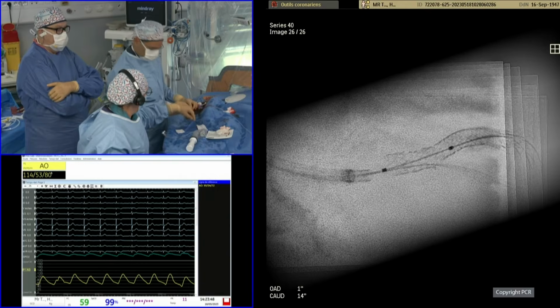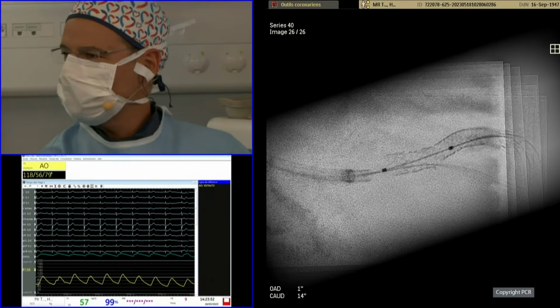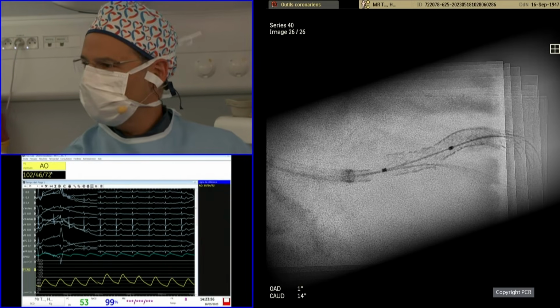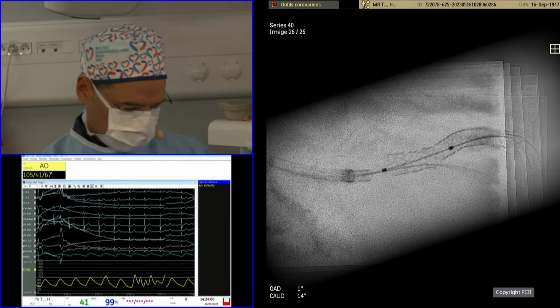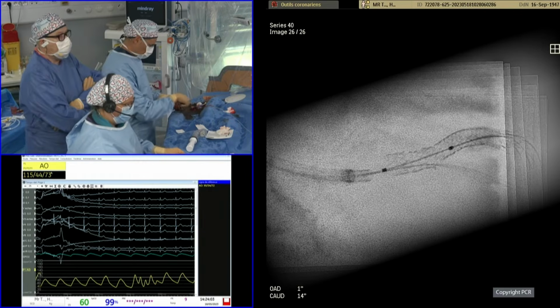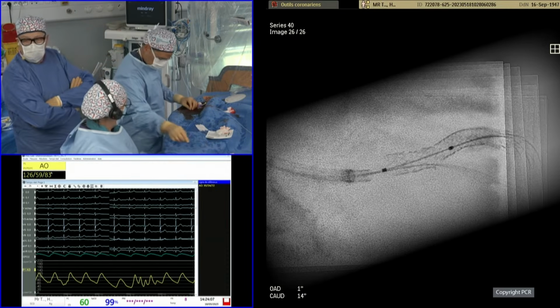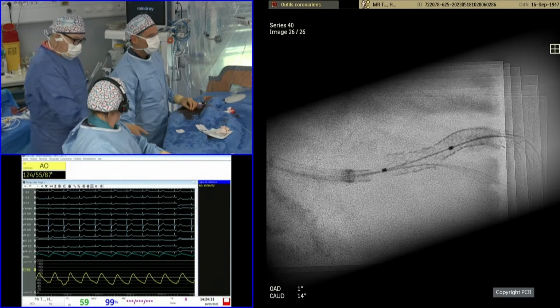So how about repot at that point? What do you think, Bernard, Yoshi? Do we go for an OFDI run or do we go for repot? I think we can do OFDI now and we'll finish by repot or any additional post-dilatation we need according to OFDI. So I think we are ready now for doing the OFDI check.